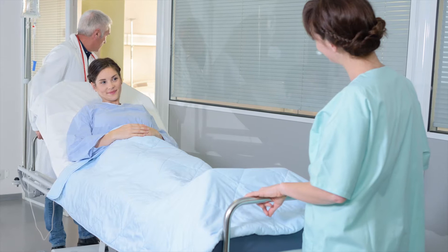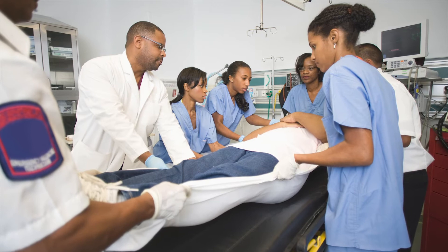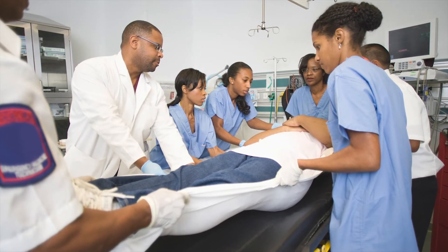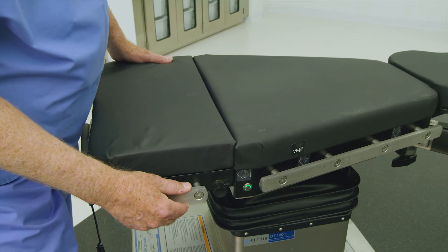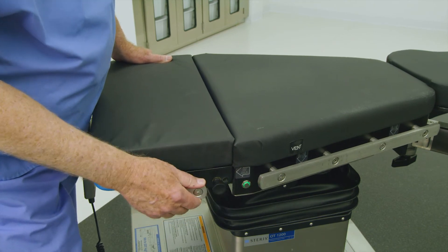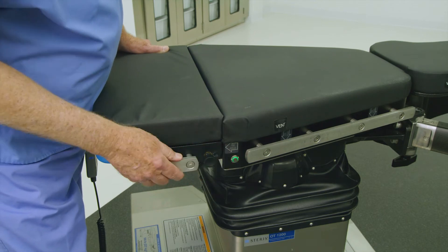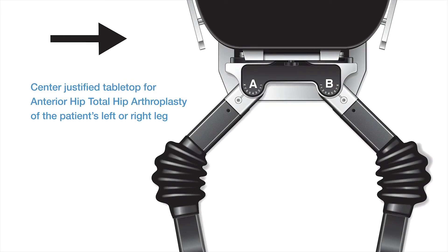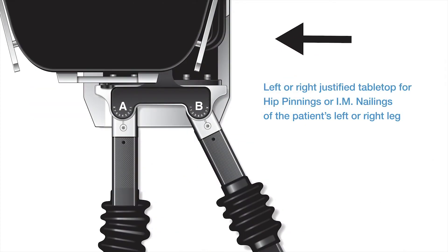Execute patient transfer using facility protocols for safe patient handling and ensure even patient weight distribution. Once the patient is positioned safely on the tabletop's surface, adjust the tabletop by repeating the instructions to obtain the desired lateral tabletop position. The centered position is typical for anterior hip cases, whereas left or right justified positions are typical for an operative left or right leg fracture or trauma procedure, such as hip pinnings or IM nailings.